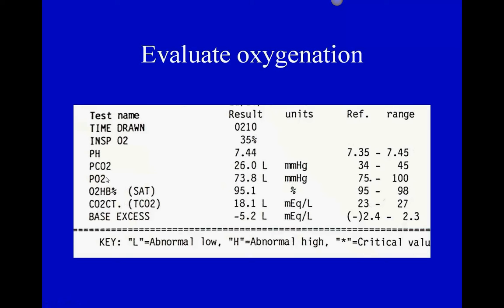And we said if their PO2 is less than 60 torr, we would say they have hypoxemia. So they do not have hypoxemia on the basis of their PO2 value. And this doesn't have little A's here because they tell you above it's an arterial blood gas.